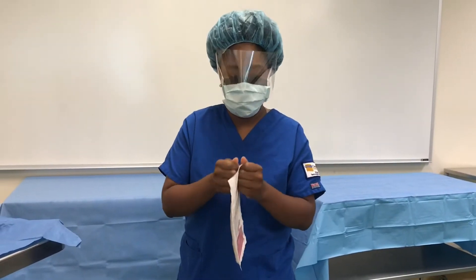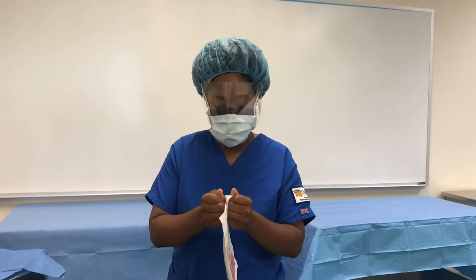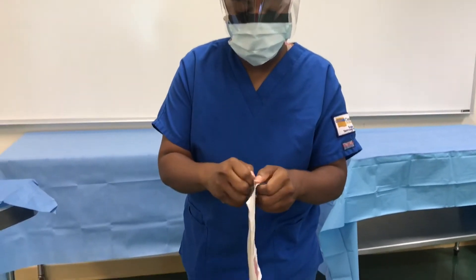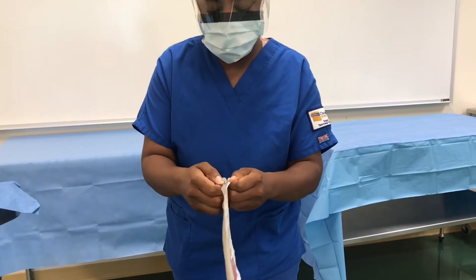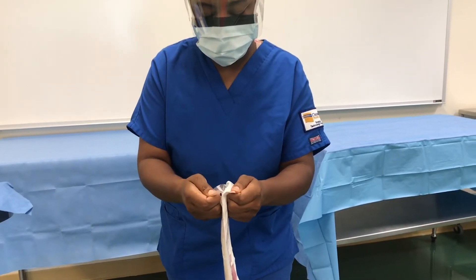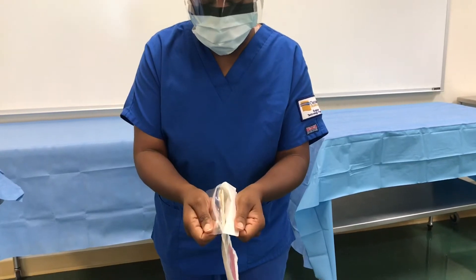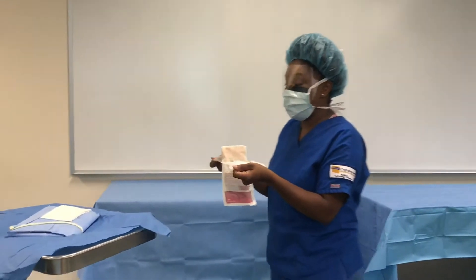While opening up your gloves, be very careful that you do not touch the inside of the package because it is sterile. Get these corners right here and bring it as close as you can, but keep your fingers away from that little white line where the sticky adhesive tape is, and then you just grab it like that.